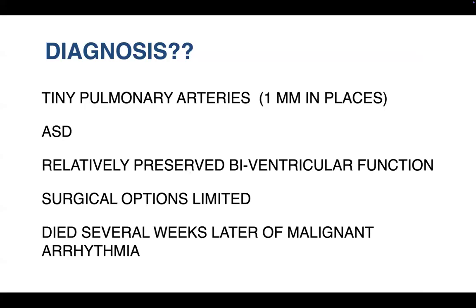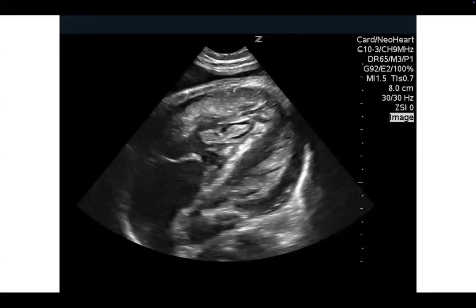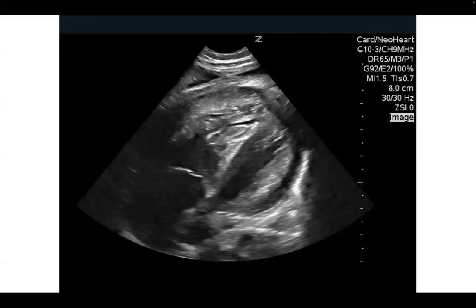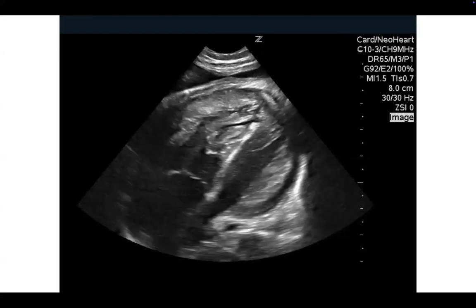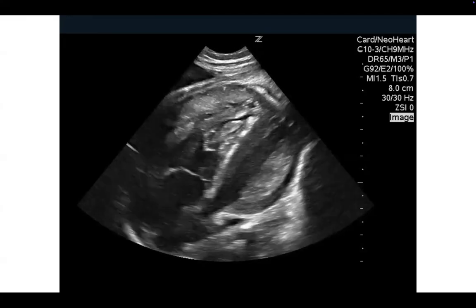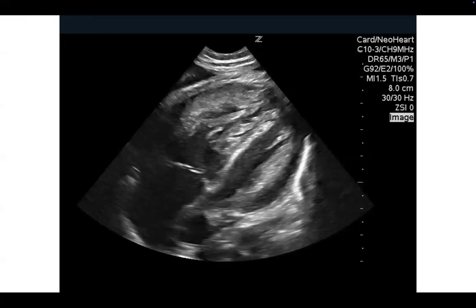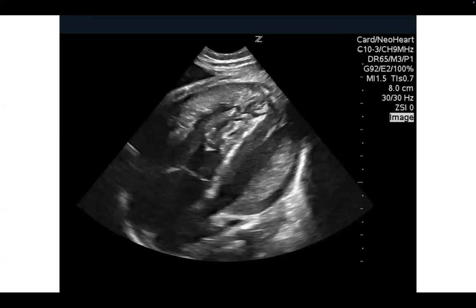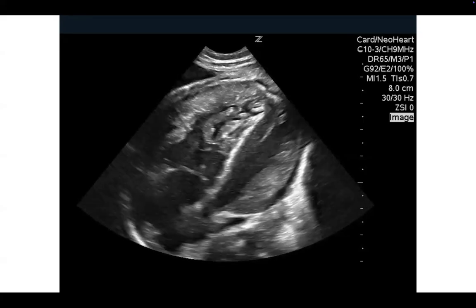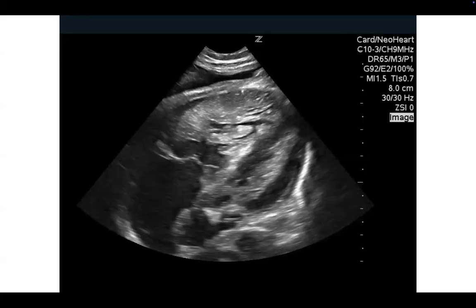The diagnosis, I'll just reiterate. When we use this, we're not using this as a diagnostic tool per se. This is where we really have to work together with cardiology because we're not using this to diagnose congenital heart disease, but we're looking at this like, okay, this kid doesn't really fit the picture of bronchiolitis. Is there something else going on? We've got a big liver.